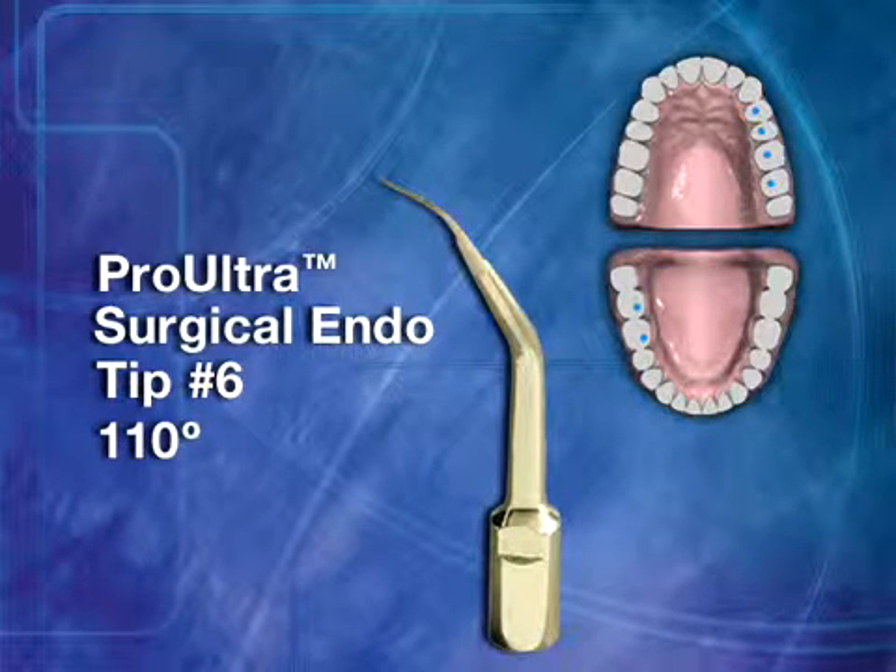Surgical Tip No. 6 has a 110-degree tip angle. This double-angled instrument is for lingual roots of mandibular right and maxillary left posterior teeth.